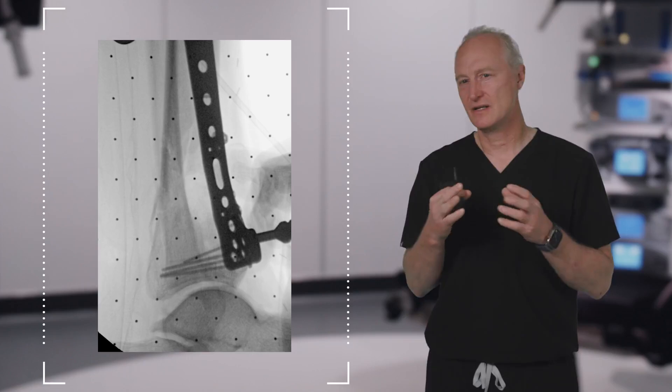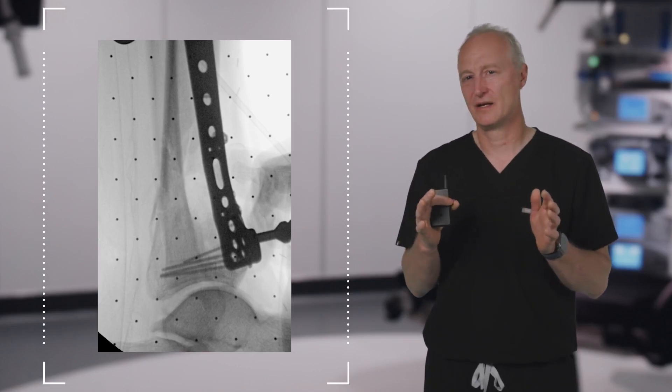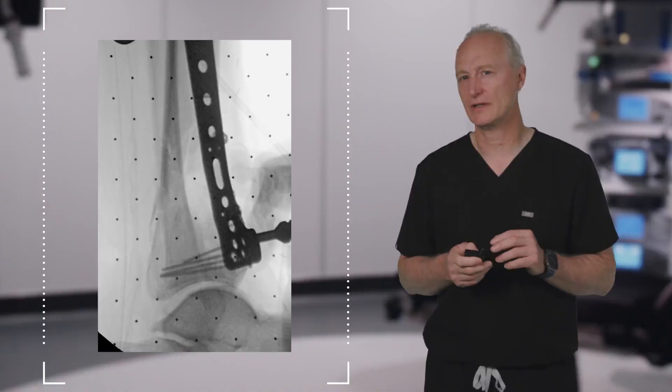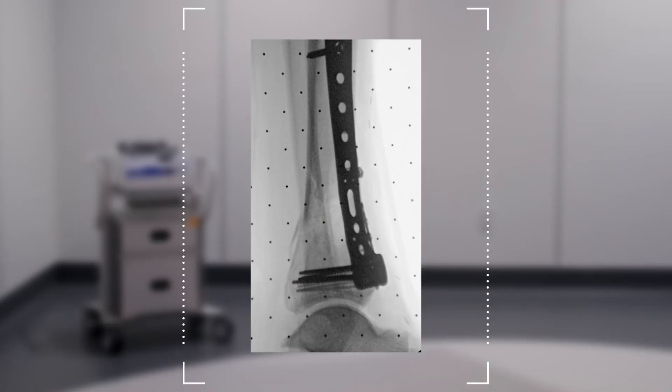Articular surface is wide with respect to the talus. Left in this position, this fracture is probably going to do poorly. Application of the crewlock compression screws, with further compression of the articular surface of the distal tibia in the AP plane, the talus is now centered under the anatomic axis of the tibia.